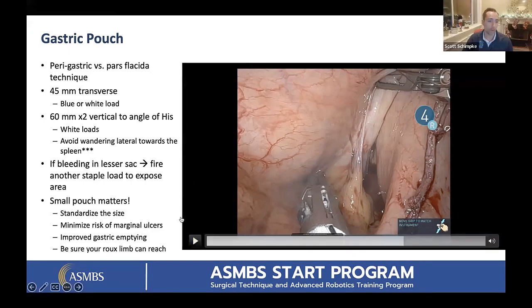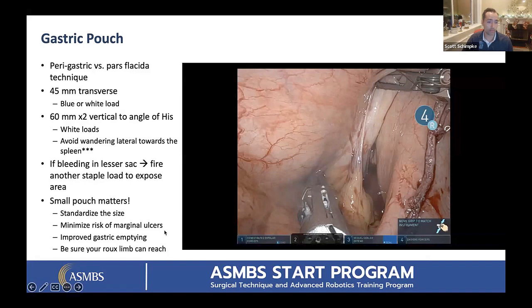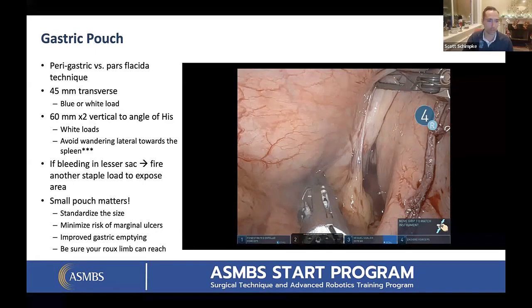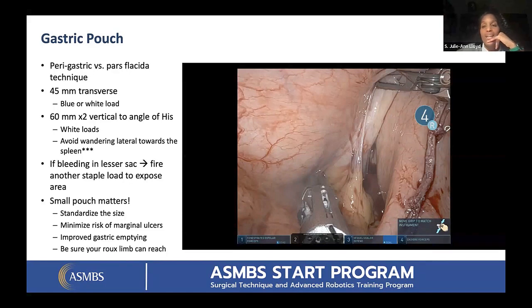Yeah. So actually, on the bypasses, any of my bariatric cases where I don't remove any specimens, the bypass would be one of them, I don't close 12s at all. Ooh. That's like a mic drop right there. It's a controversial topic for sure. Now sleeves, of course, where you're taking stomach out of the 12, I absolutely close that. If I take any specimens out, I will close it, but if it's just a port and I don't remove anything from it, I don't close the 12. Same with duodenal switch as well. Living on the edge, huh? Yeah, living on the edge.